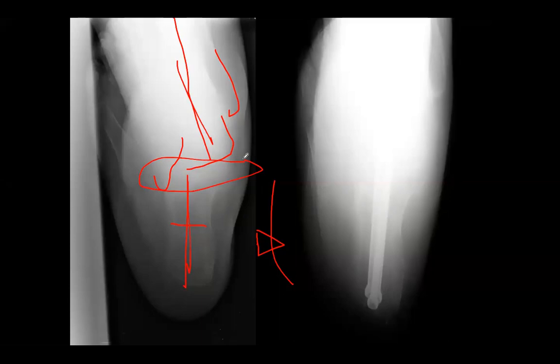So in that case, we can bring the calcaneus over, prop up the talus to get back on top here. And then now you can see if we bisect the tibia, the talus, and the calcaneus, besides my shaky hand, it all comes in one line right there. So we bring that back over. So these are things to look at when you're evaluating a subtalar joint on a calcaxial.